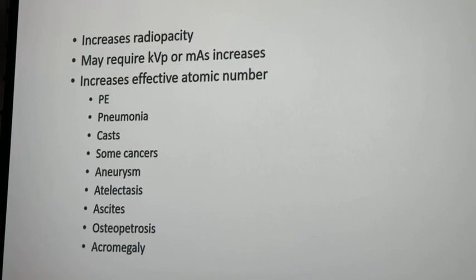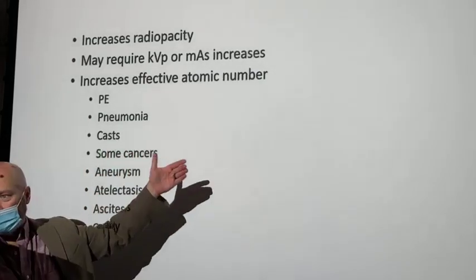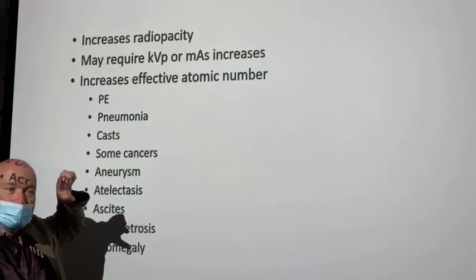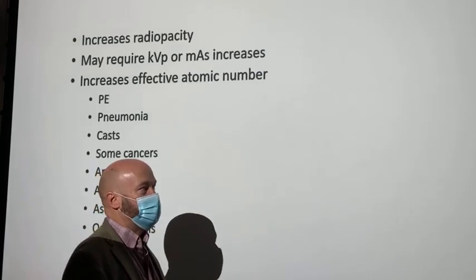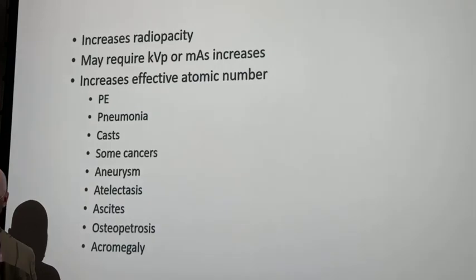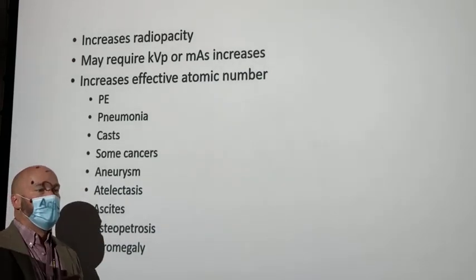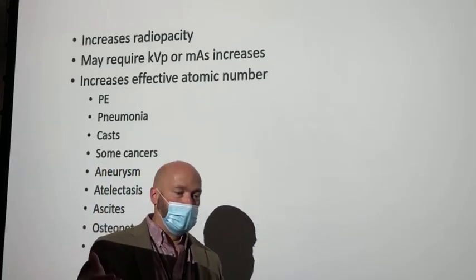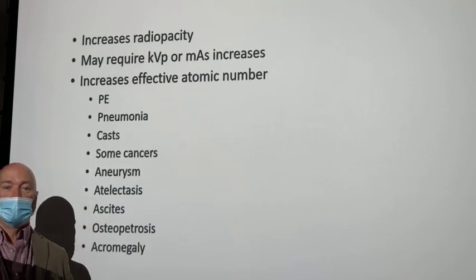You would think so, but no. All right, so this is where it gets dicey. You're going to have to increase something because you've got an increase in patient density. A very drastic increase in patient density, you lose radiographic density. Now, in some conditions where we increase the patient density, we need to increase kVp because we need to increase penetration. But as we increase kVp, what happens to the interactions inside of the patient? You get more scatter radiation, right?